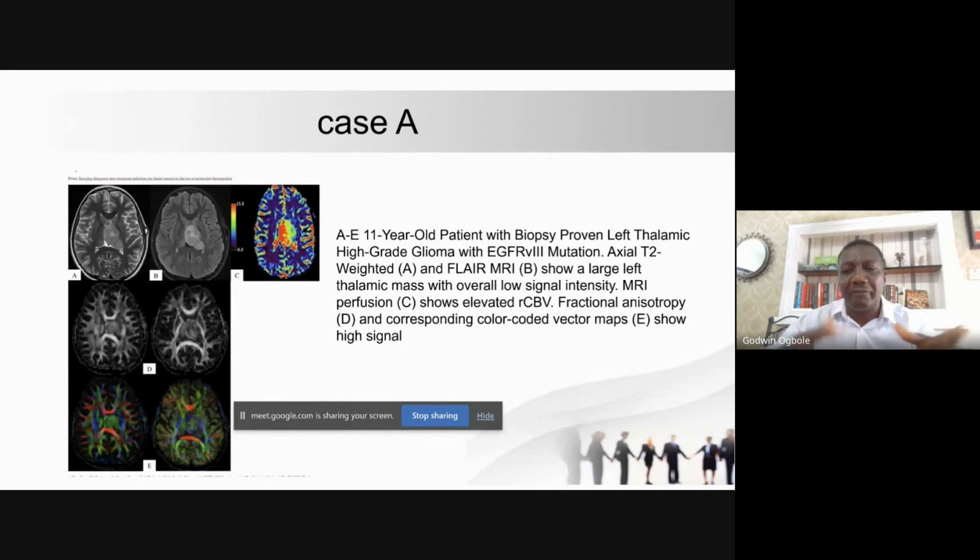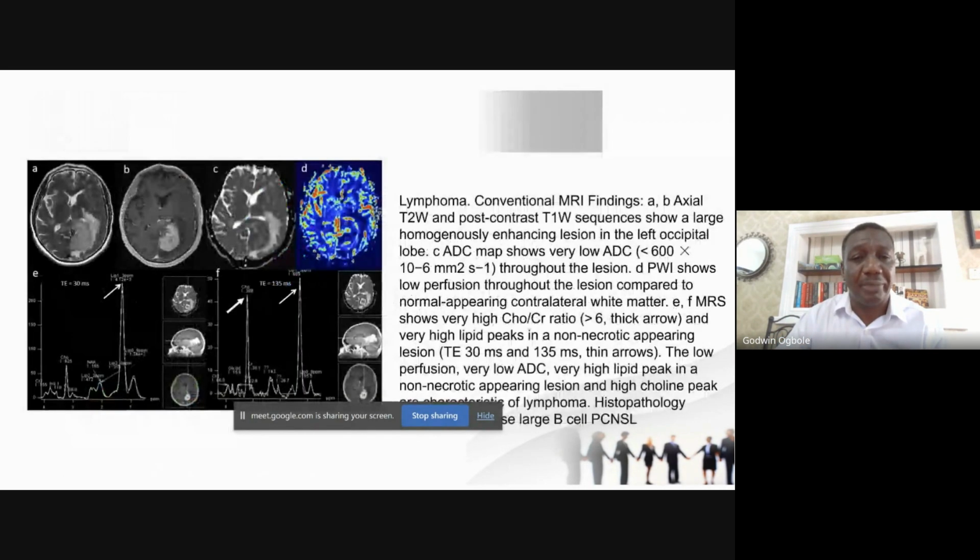Apart from that, you also have perfusion MRI that looks at the blood flow within the tumor. The blood flow helps us further characterize the tumor. Is it very vascular? Is the vascularity increasing or decreasing? These are techniques that can be used in further monitoring patients.